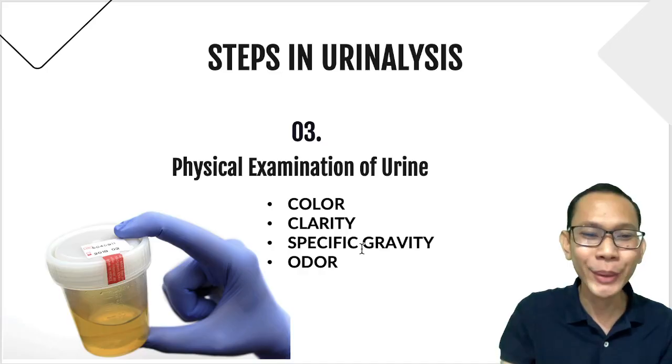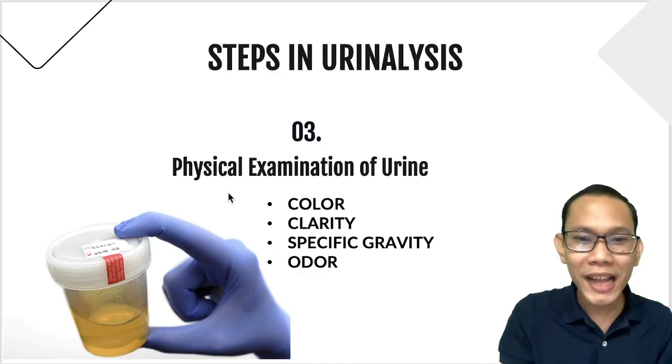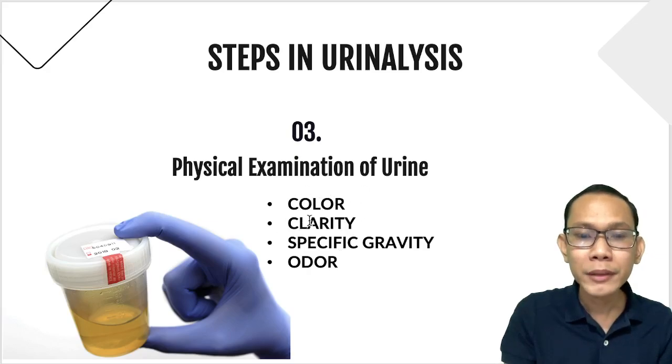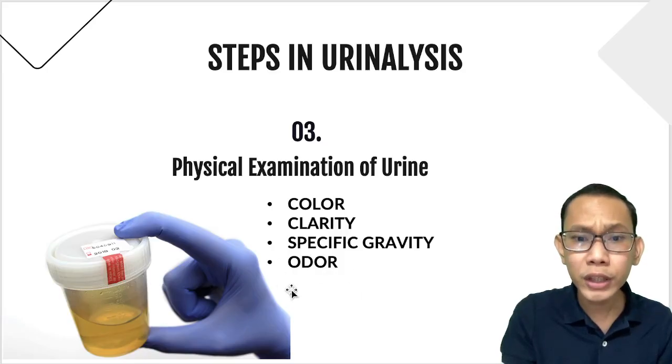Sige lang, later on, we will discuss now. So again, ang ating discussion will focus more on the color, clarity, and your specific gravity because this is the routine part na ginagawa natin for your physical exam, and your odor is not part of it. It's not part of the routine exam. It may give us a hint or a clue but not part of it. Your odor will be discussed thoroughly sa lecture part. Okay?